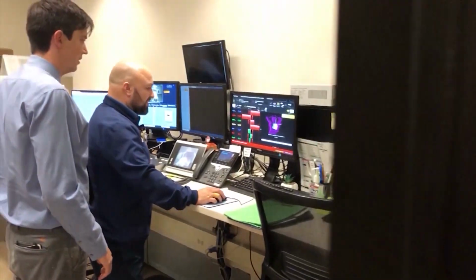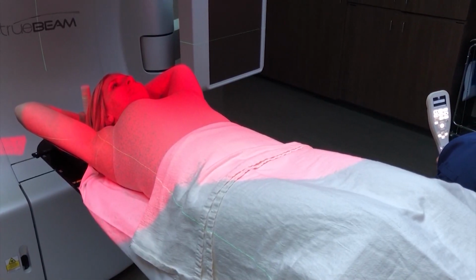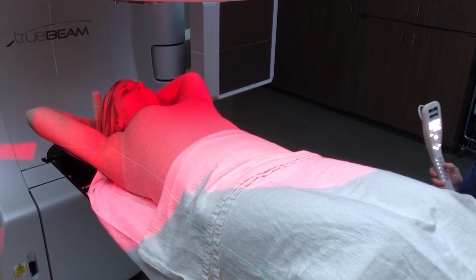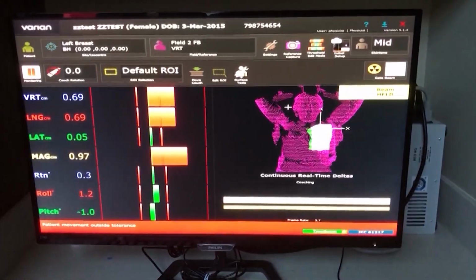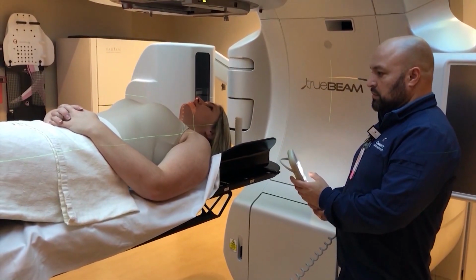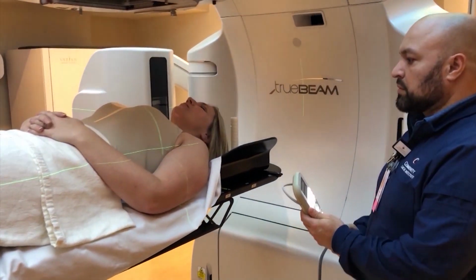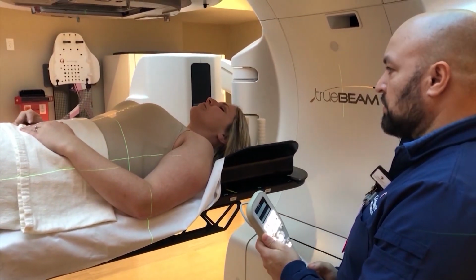Radiation therapy is one of the most common treatments for cancer. It works by damaging genetic material within cancer cells, causing them to die. However, normal cells can be affected by the radiation. Surface-guided radiation therapy is a new modality, relatively new and brand new to us in the Valley, to basically help align patients even better and also to provide some technique improvements in accuracy, alignment, and also in the breathing cycle of a patient to deliver radiation therapy at the optimal time.